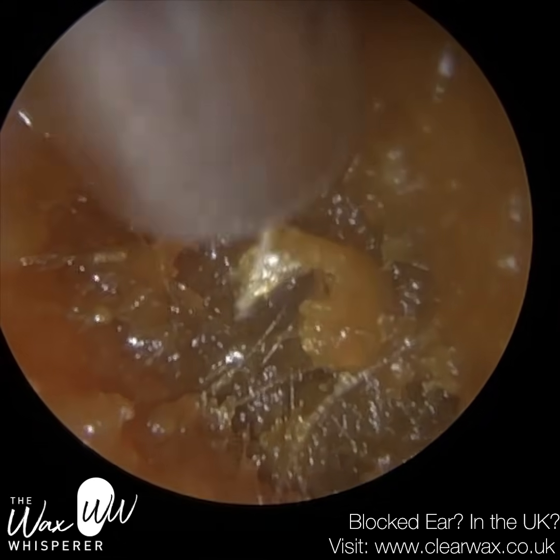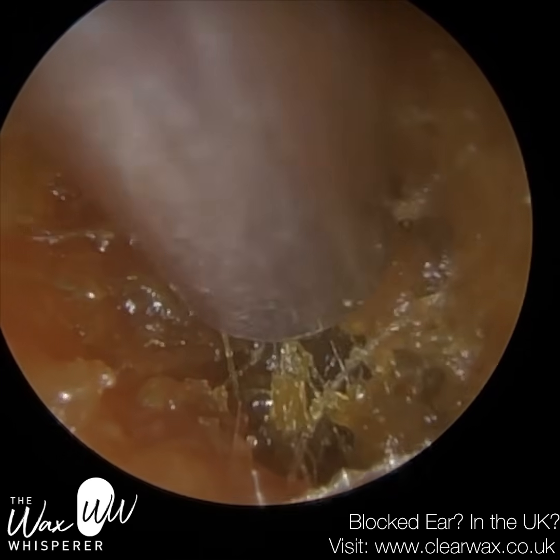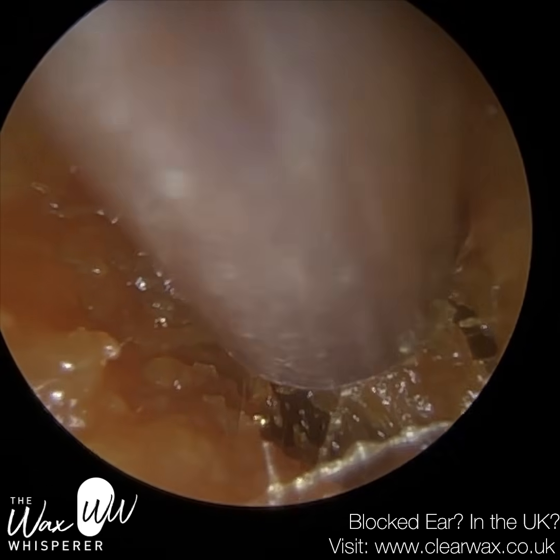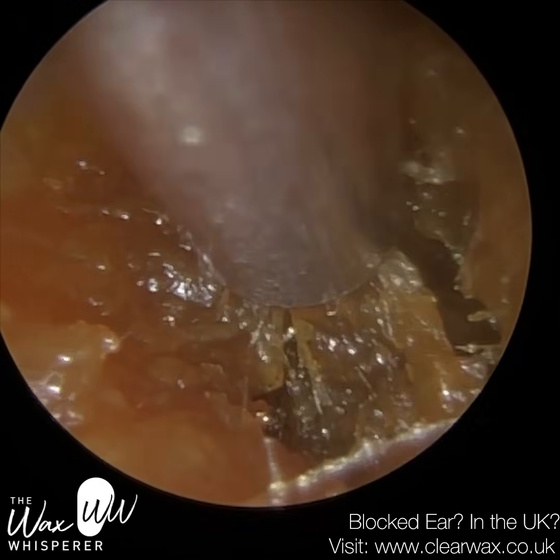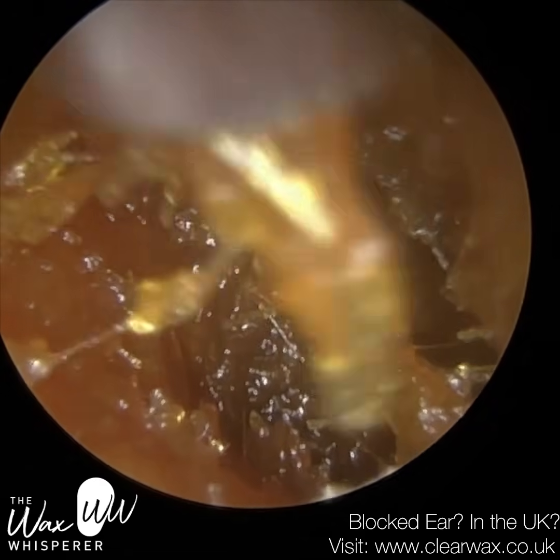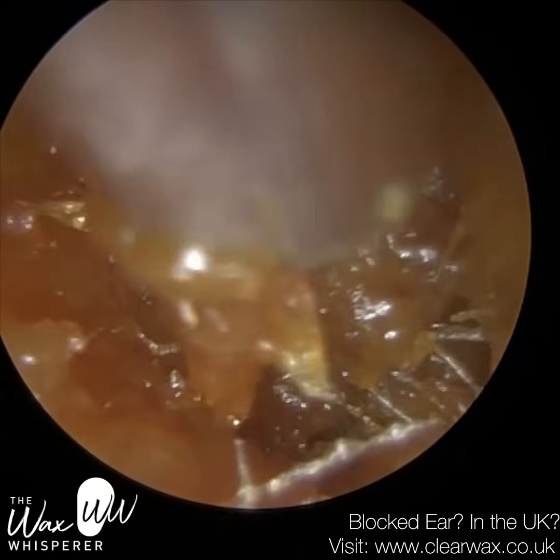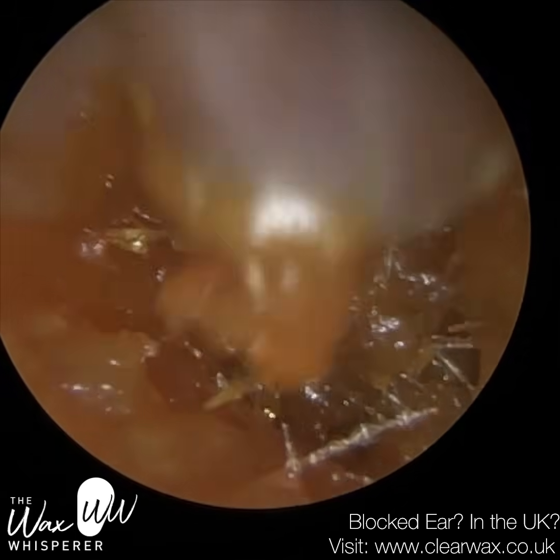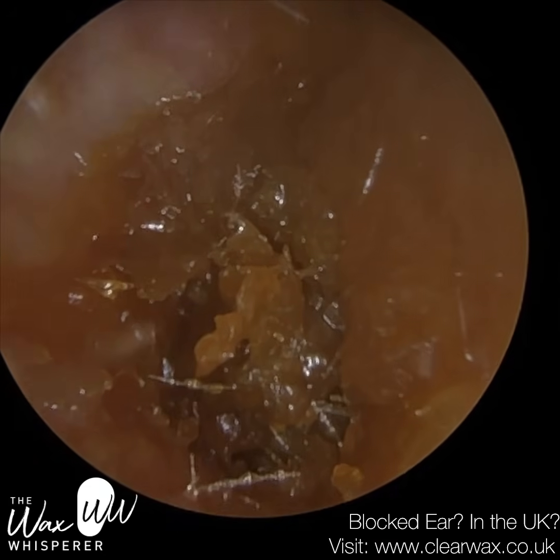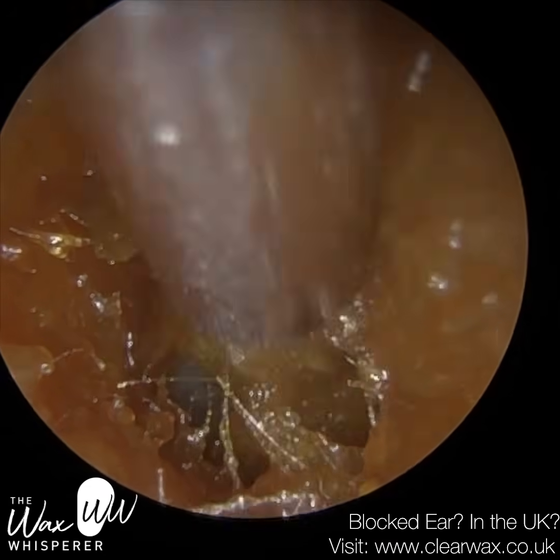It's hydrogen peroxide based drops, and the reason why I'm not keen on that is, well, twofold actually. It's water based and alkaline, which some people can get a bit of irritation against. In addition, it turns the wax like mashed potato. It's very hard to vacuum, and when we're this close and deep into the ear, when you've got wax on the canal wall, you can't really use an ear hook or Jobson horn. You're going to have to suction this out, because again, you're going to otherwise make contact with the bony part of the ear canal, which will be uncomfortable for the patient.